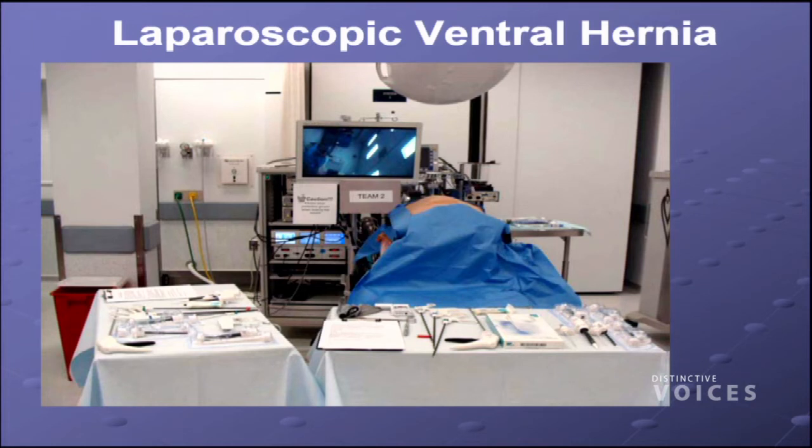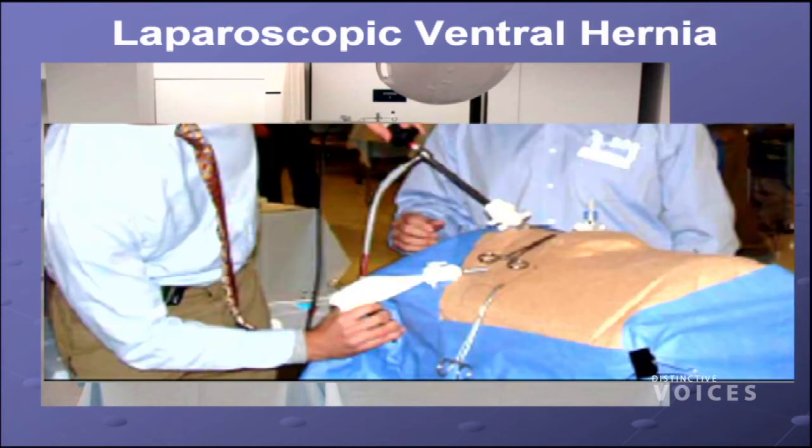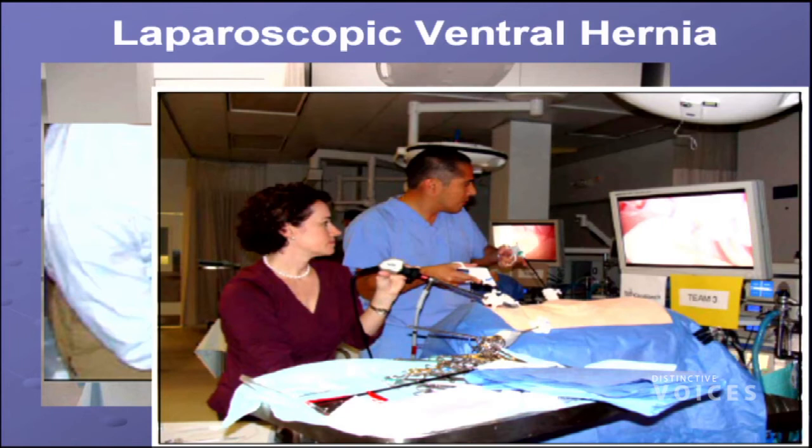But in this instance, I'm able to do a lot more in terms of clinical variation than is easy enough to do with the VR products. This is a close-up of the hernia and one of the surgeons in a course repairing the hernia. We set it up like a real operating room with a patient, and they're using the same instruments that we use in the operating room, except for the cautery, because then the patient would catch fire, and that wouldn't be fun. So that's the only instrument we can't use.